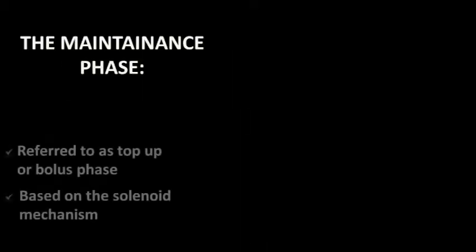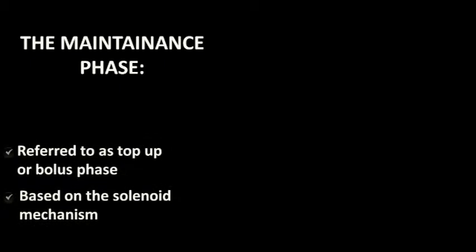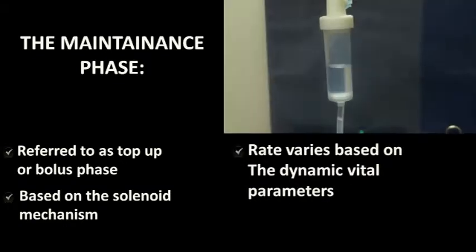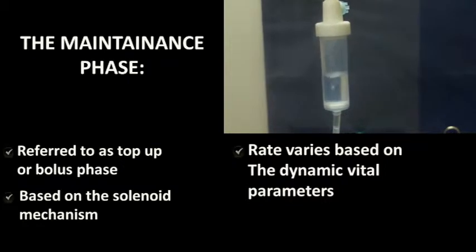The second phase is a maintenance phase used to keep the patient in an anesthetized condition. The dosage is administered using an infusion set controlled by a solenoid valve. The rate is varied based on the vital parameters.